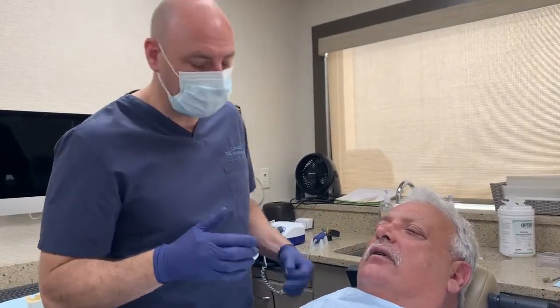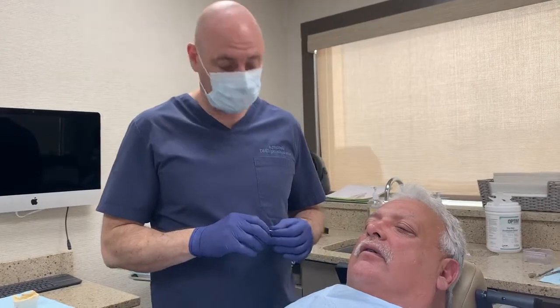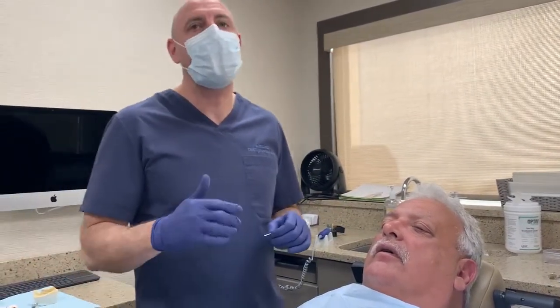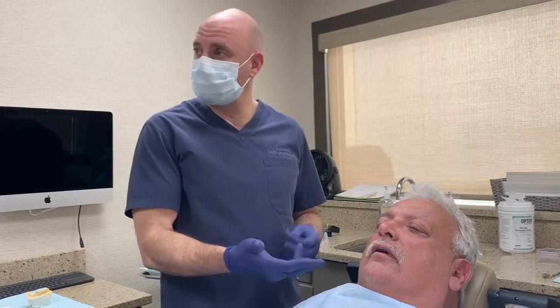Yeah, I wanted to open them up because you don't want a super vertical overlap when you have these types of prostheses. So this is by design. It's not maybe what he would have if he had a fixed prosthesis or his natural teeth over time. But he's also skeletal class 2.